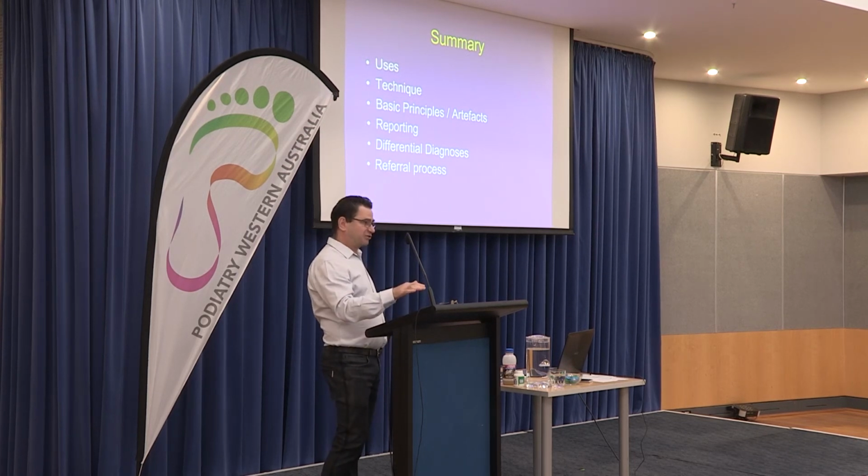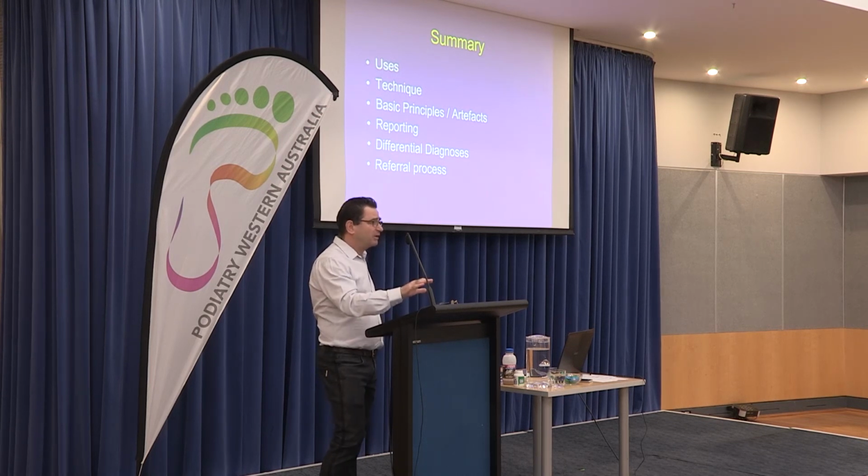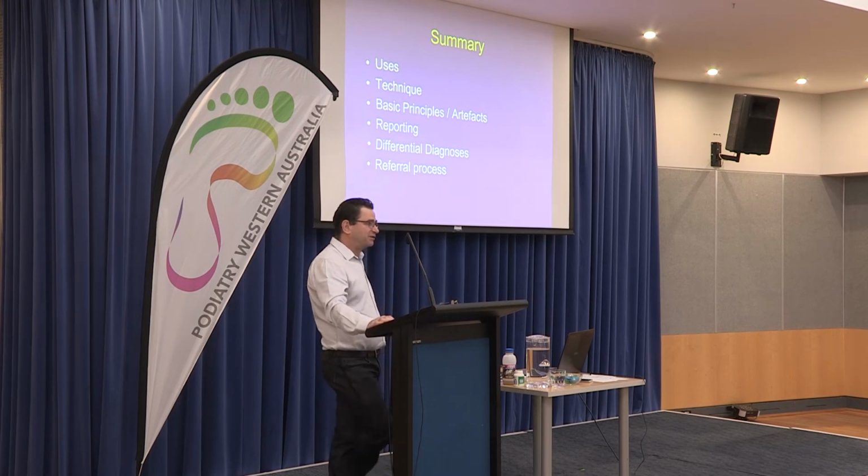It's kind of helpful for us to see, what is the spring ligament and the tibial posterior tendon like? Are they hyperemic? Or is this a more acute thing? Or is this chronic and they might have been like that for 10 years and they might be presenting with something else? So the short answer to your question is, yes, you can see the thickening at MR.